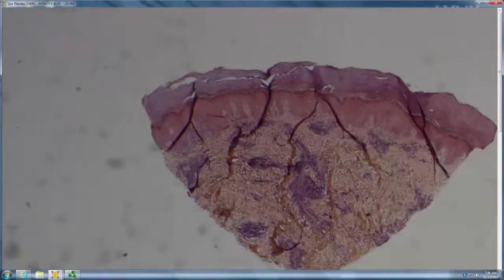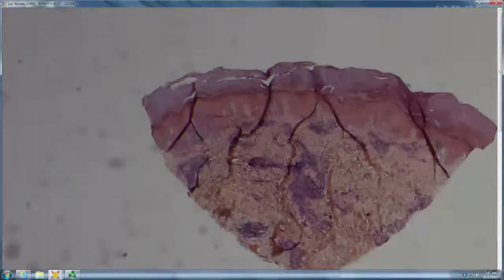Alright, so they punched into this, and it looks like it's got a lot of extravasation, a lot of inflammation. So when they punch, with the exception of punching out a small dark pigmented lesion, you're usually looking for itis, not oma, right? So it's probably an itis question, but so is everything in this box. I'm trying to see if it's just the staining or if there's a lot of EOs mixed in throughout.